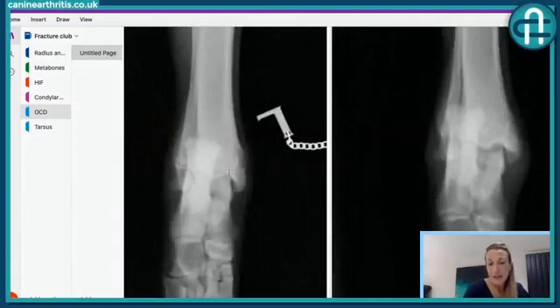The left ankle here is normal. We've got the end of the shin bone or tibia here, the little splint bone or fibula down the side, and then a bone called the talus here, which you can follow the outline of. It's almost like an upside-down egg box — it has two ridges, one on the outside and one on the inside. Just above those ridges there are corresponding dips in the bottom of the tibial or shin bone, and the gap between those makes a very even black line — that's the joint space, the hinge point for the ankle.